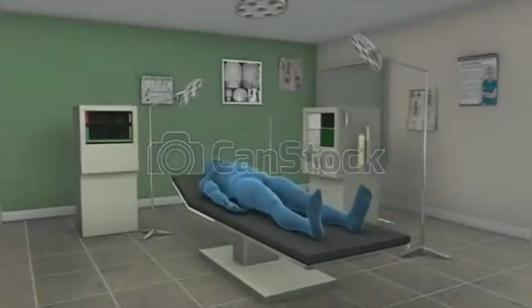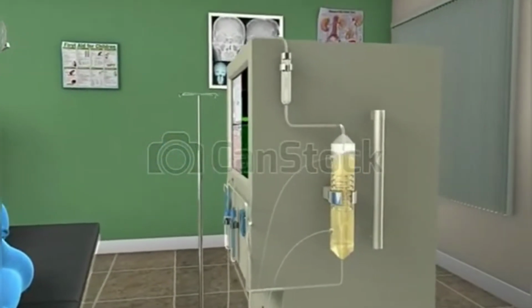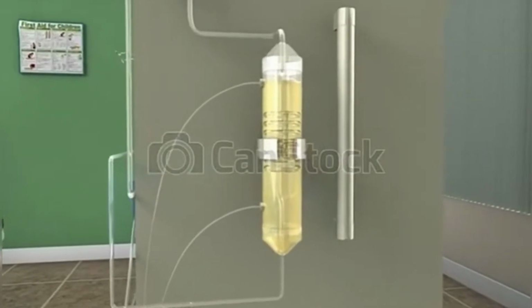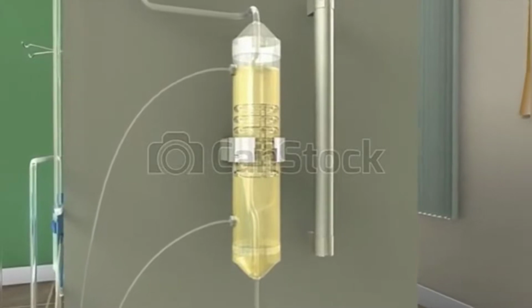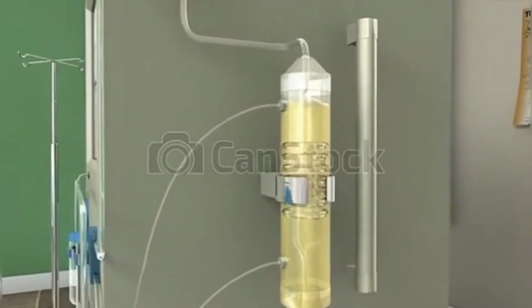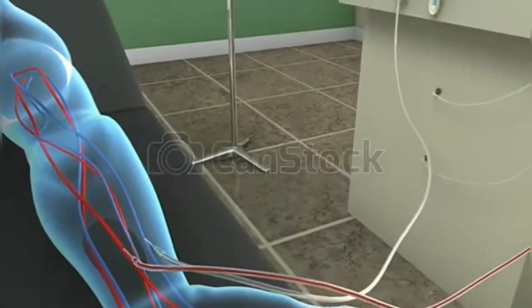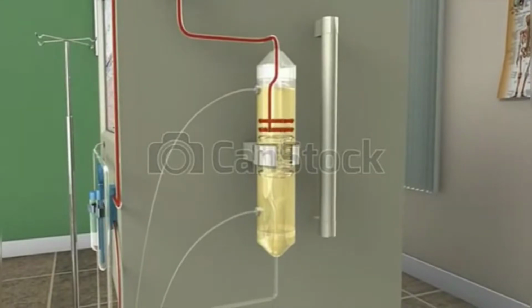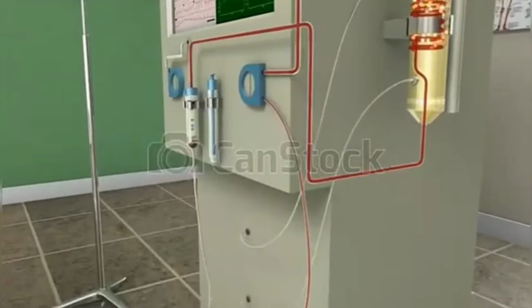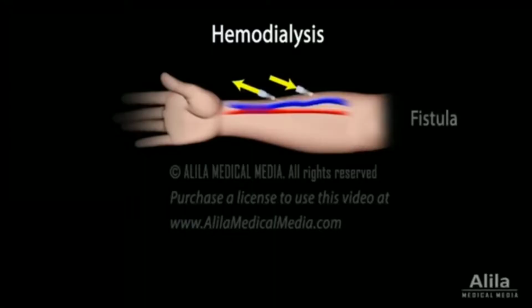The process of dialysis is then done to filter waste materials from your blood. A dialysis machine consists of a series of membranes that function as filters and a specific liquid known as dialysate. The dialysate fluid filters waste materials from your blood, which are then transported via membranes. The dialysis fluid is pushed out of the dialyzer, and the filtered blood is returned to your body through a second needle. Two thin needles will be placed and taped into your AV fistula or graft.